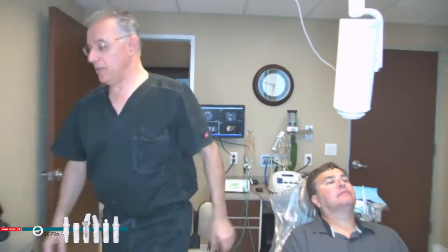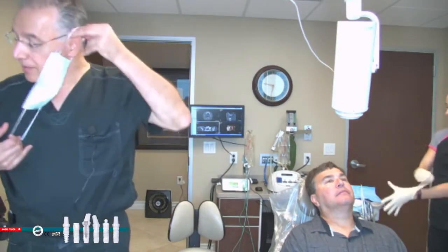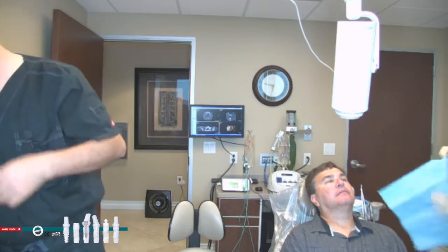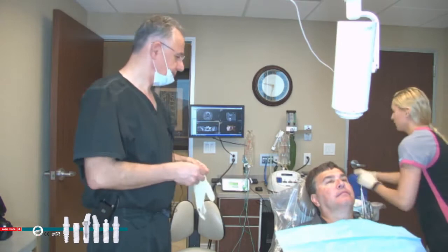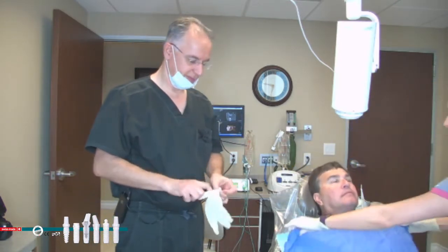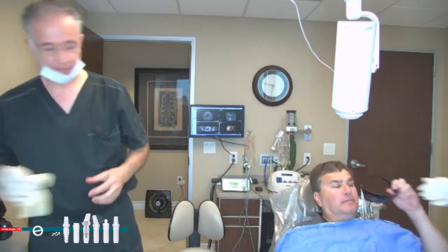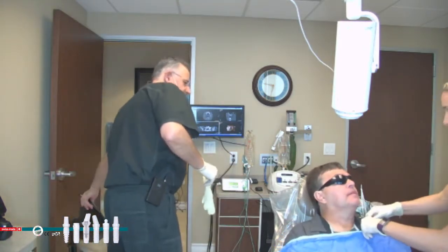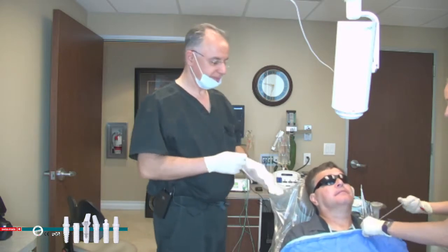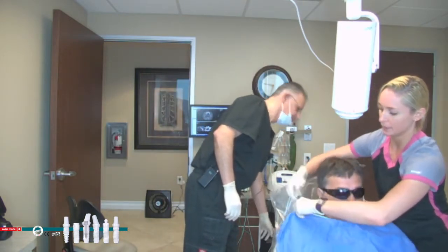Okay, so we're going to put our mask on. I'm going to give you some sunglasses to put on, okay? Just to block the light. Here you go. We're going to start with rubbing some gel in there to kind of help with the getting you numb, okay? Go ahead and lean your head up just a little. Perfect. We're going to go ahead and lean it back.